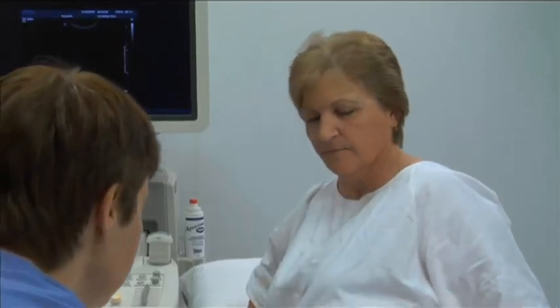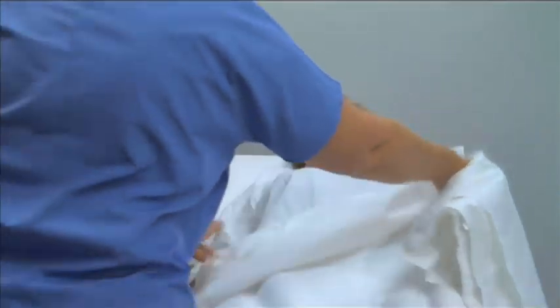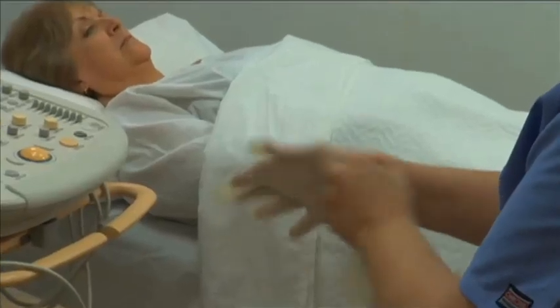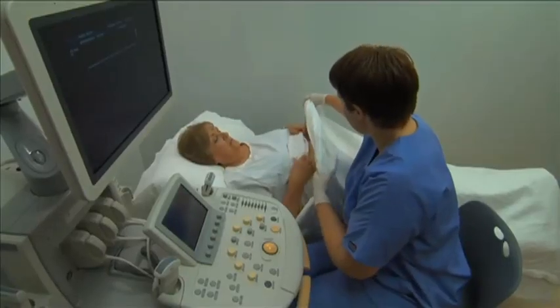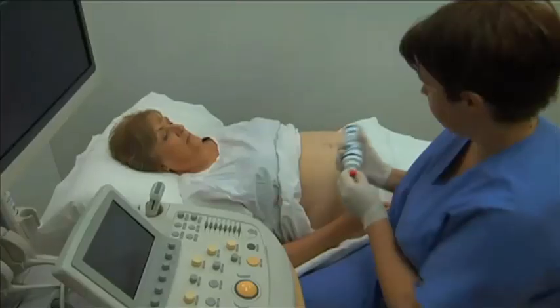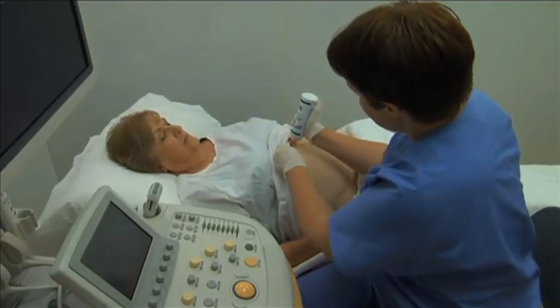Ask the patient to lie supine on the bed and make them comfortable with the use of pillows or wedges positioned as required. Put on gloves. Expose the patient's abdomen, maintaining privacy where possible, and apply the pre-warmed acoustic gel to the epigastric region.